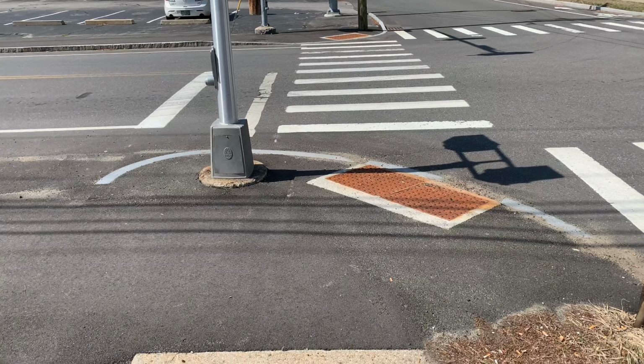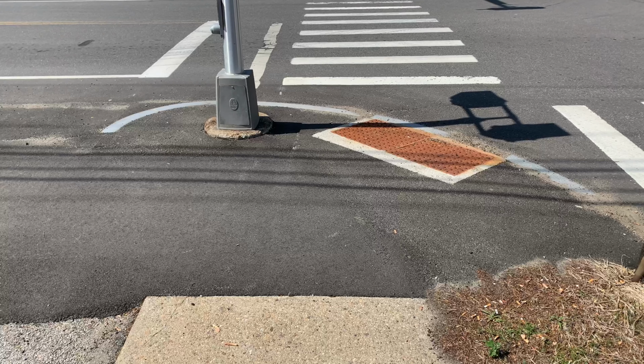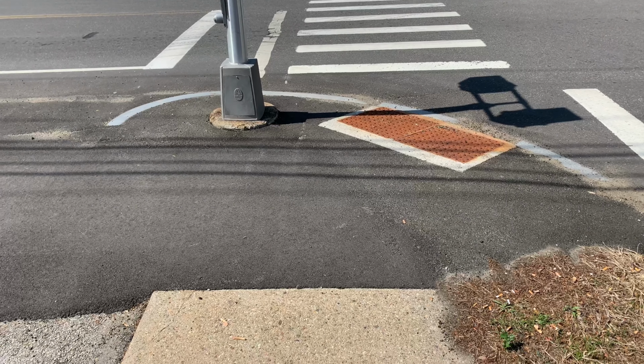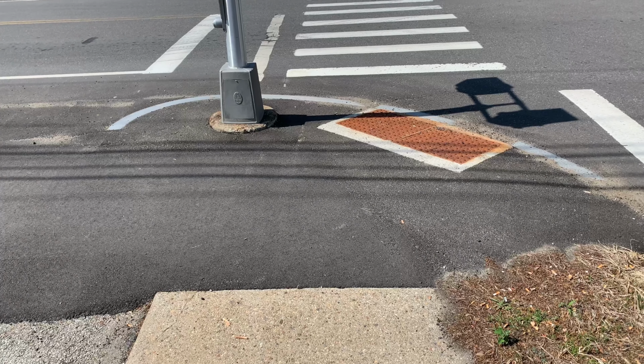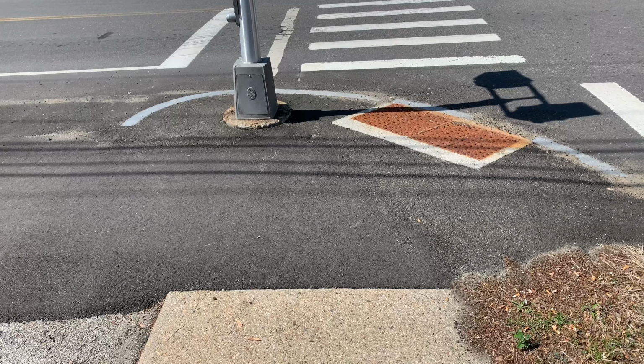And for the final corner that I want to talk about for this video is blended corners with tactile warning strips or bumps. There's a lot of different names for them, but in front of me here I have a corner, and the corner there's a rectangle, brownish copper looking color with these bump dots on it. And that is another way of knowing that you arrived at a corner, if your cane is able to find those bumps. So that is another way of locating this corner here.